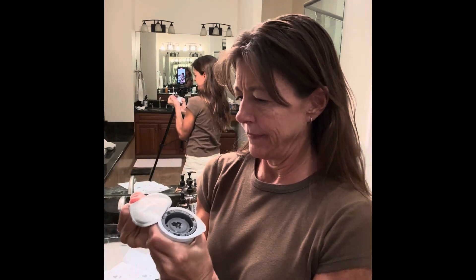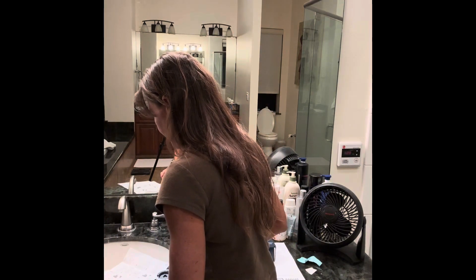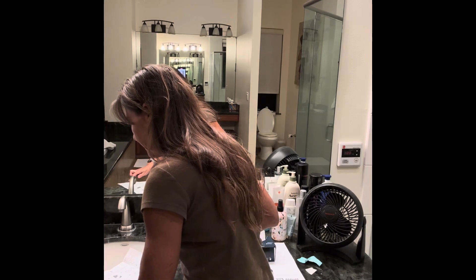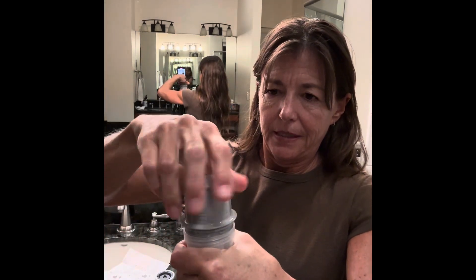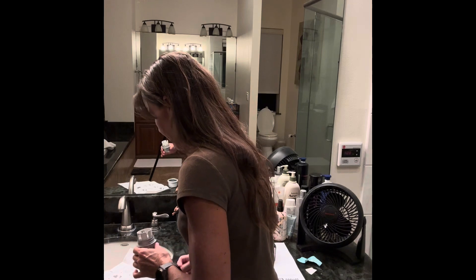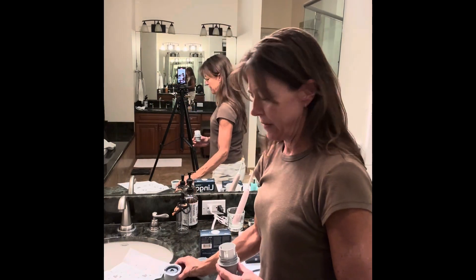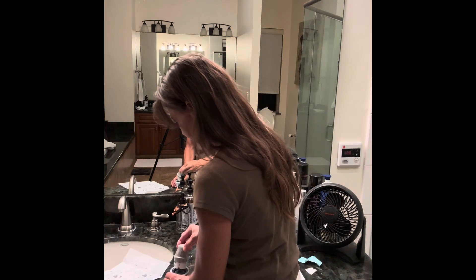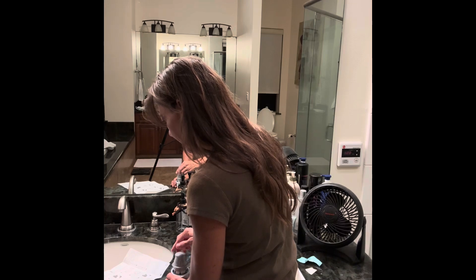It looks like this. Then I'm going to unscrew the cap from the applicator. This is the applicator, so I'm going to unscrew the cap. Then I'm going to line up the dark marks on the biosensor — I don't know if you can see this — and then press down firmly until it comes to a stop.